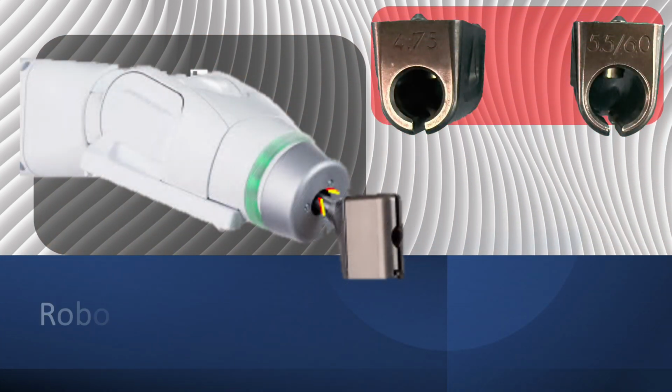The arm guide is attached to the distal tip of the surgical arm after draping. It provides a guiding channel for surgical tools, including the knife, sleeve, drill, tap, and screwdriver with screw. Additionally, it holds the snapshot tracker and target extender with fiducials in place during image acquisition for the registration process. The arm guide is available in 2 sizes, 4.75 mm and 5.5 mm, compatible with corresponding instrumentation systems.